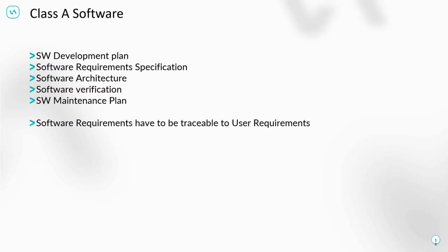And the same, as you see in the last bullet, between software requirements and the user requirements: there also needs to be end-to-end traceability available. So you can trace that as well. Since validation is a different topic, it will come from a side stream. However, you have this particular traceability available.